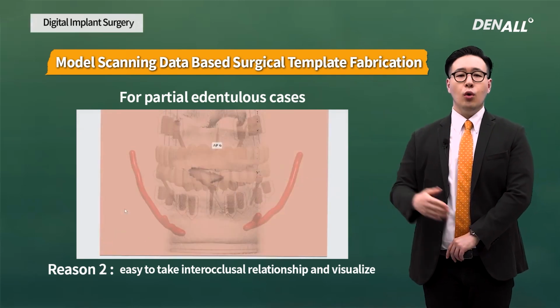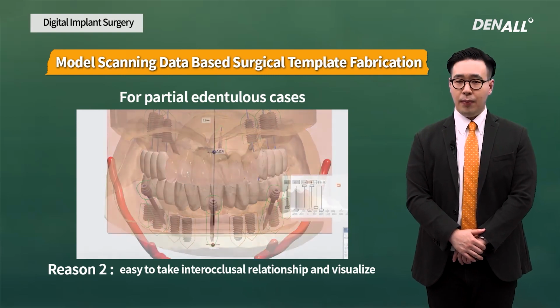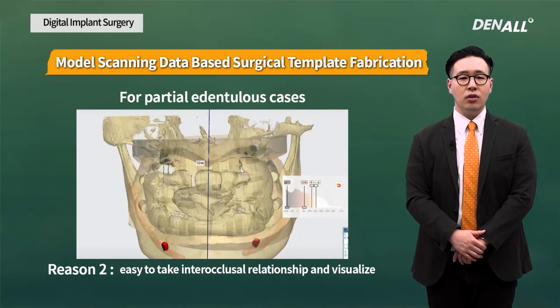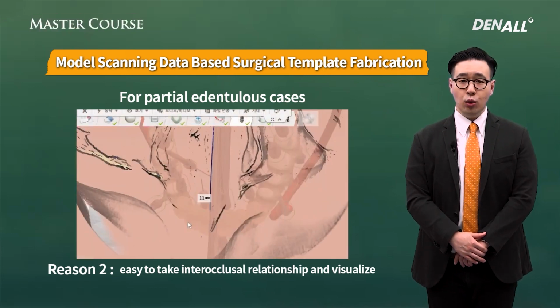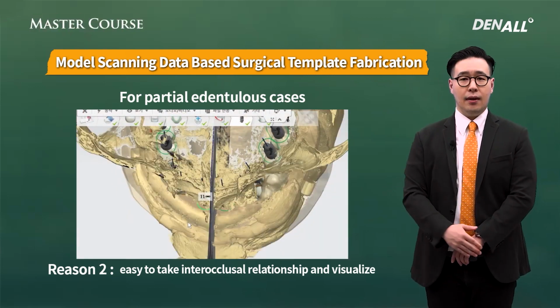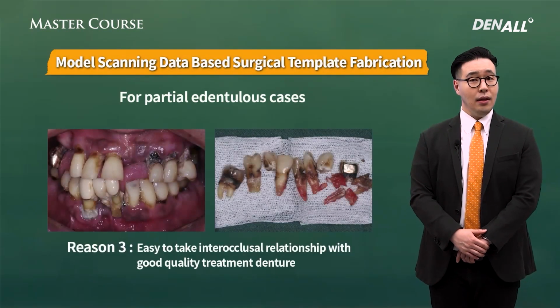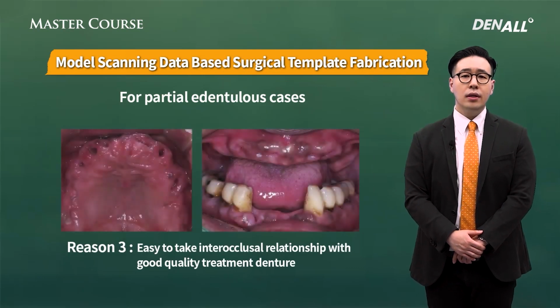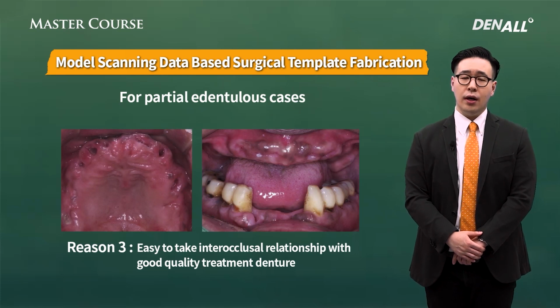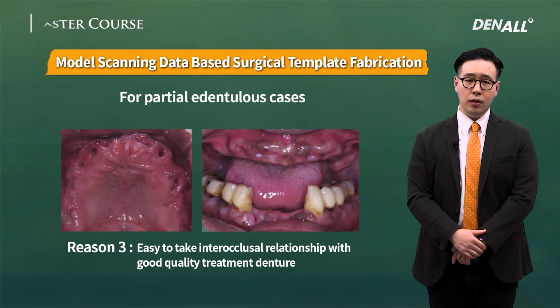In the video, by referencing the patient's anatomic structure, for example, the nasal septum or nasal spine, on the stable interjaw relation, the midline and temporary prosthesis are positioned. If after extracting hopeless teeth, we have to wait a certain period of time until healing, for function and social activity, a treatment denture may have to be used.